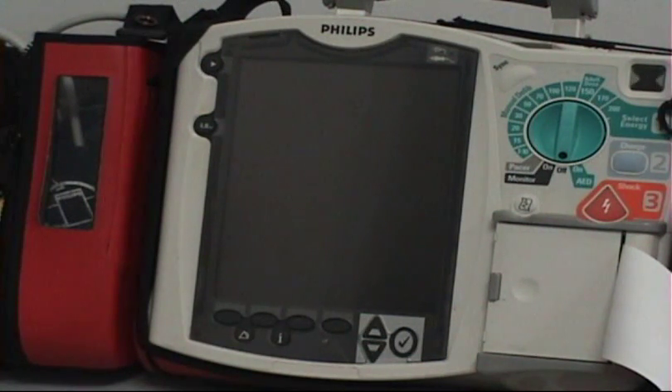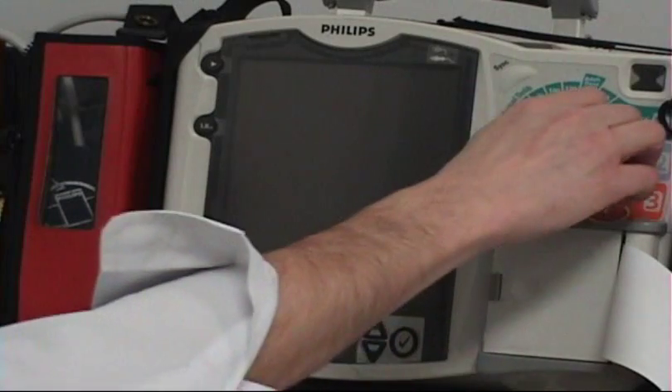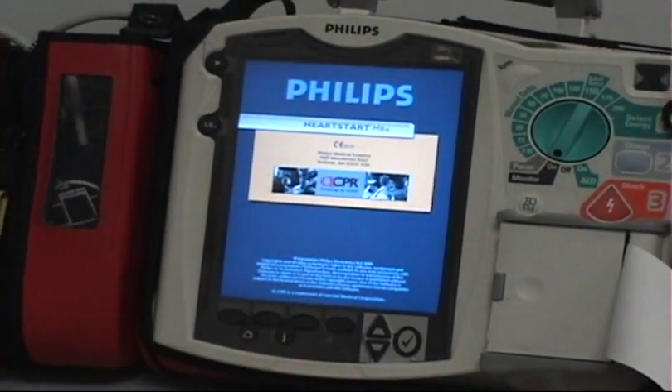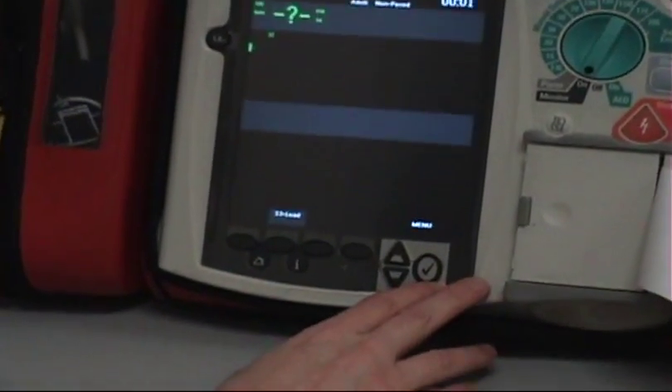First thing is make sure your Toughbook is on and you're logged in. It doesn't matter whether you have mobile open or not. You're going to turn on your cardiac monitor to monitor mode. Once it goes through its self-check, we're going to select menu momentarily when it comes up.